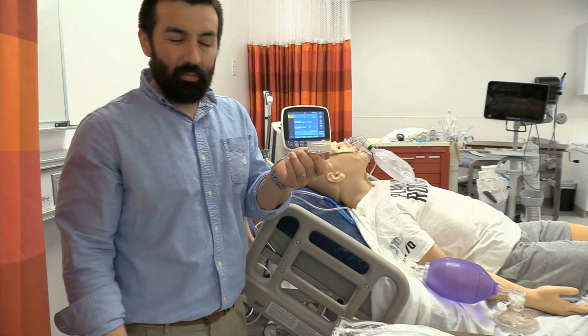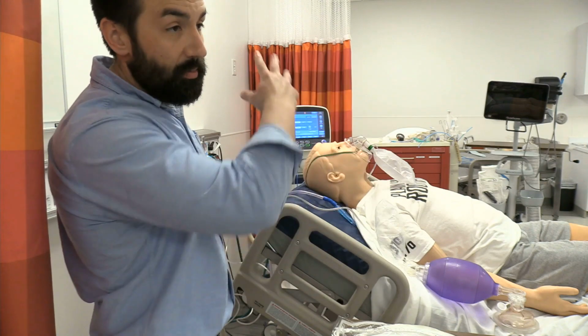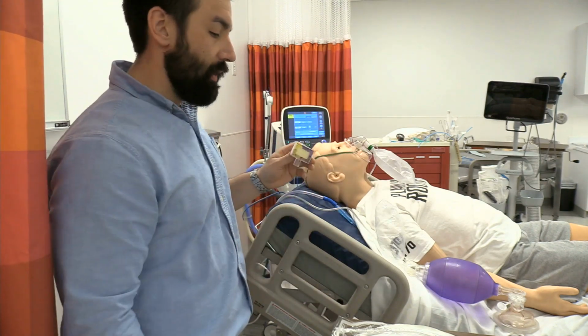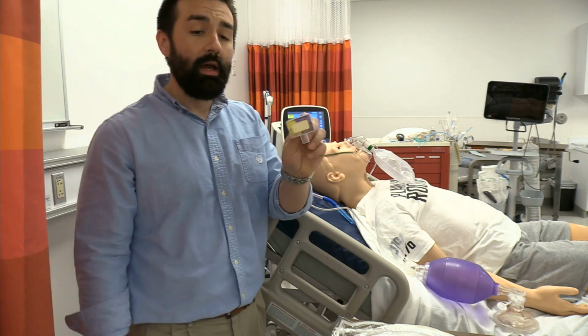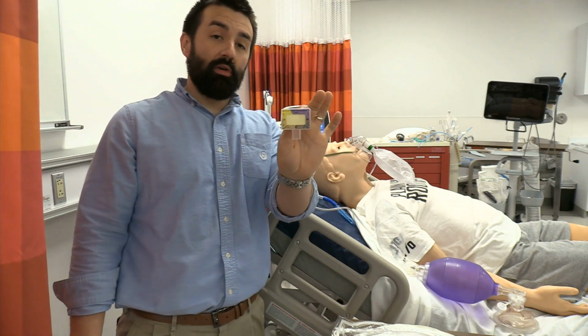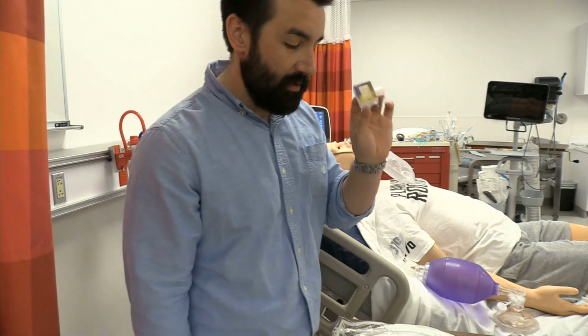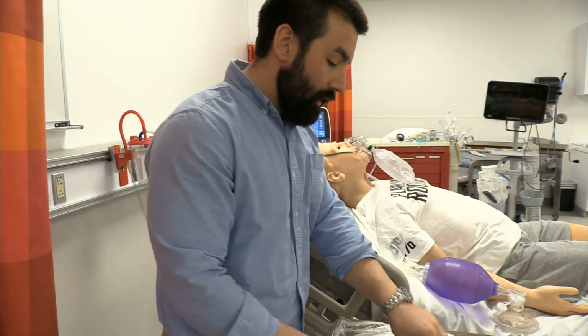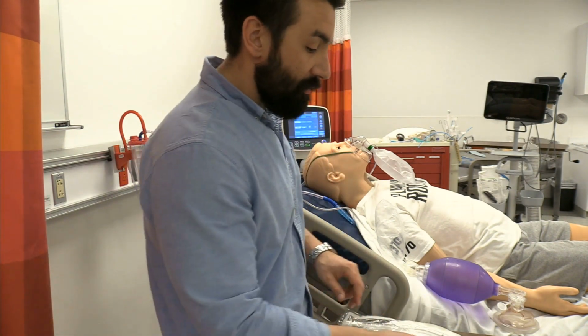Colorimetric CO2 is what we use a lot. You can use continuous waveform capnography, but that would have to be hooked up to whatever module or some sort of device to be able to give you a number and a waveform. This one has been exposed to room air for a long time. These generally start out purple and turn yellow in the presence of carbon dioxide, so don't let that fool you. I already have a syringe for inflation of the cuff. I'm going to show you how to check cuff pressure afterwards.